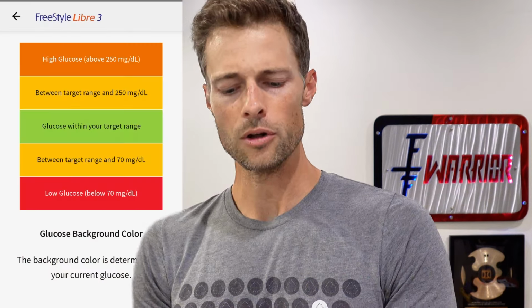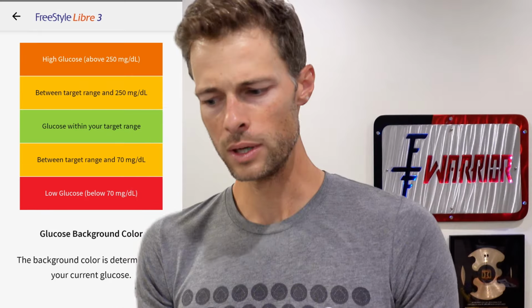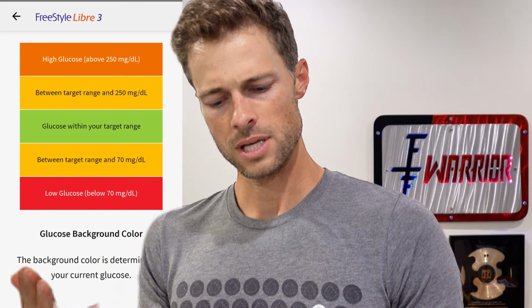But we've got the trend arrows, the glucose graph, glucose messages, notifications. It shows what the colors are going to look like based on the background color. Red is low. Yellow is either just outside of the ranges, 70 and 250. And then orange is high glucose.